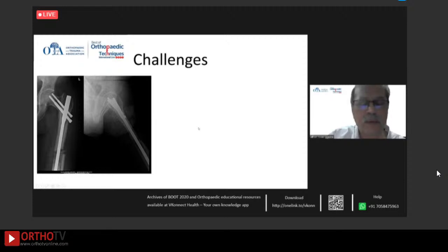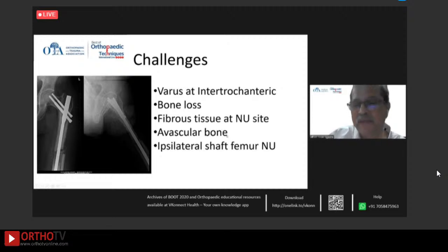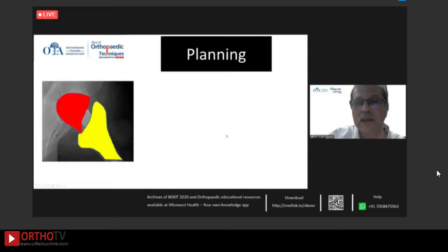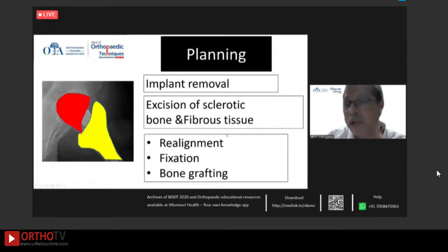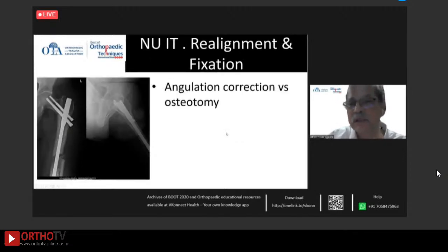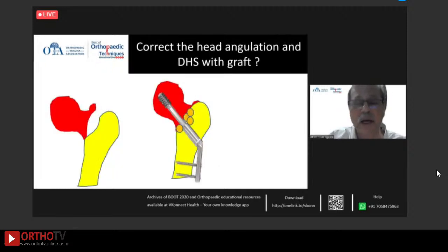So, of course, the challenges were varus, bone loss. Obviously, there's bound to be fibrous tissue at the non-union site and avascular bone. And of course, we have an ipsilateral femur. So, obviously, one needs to remove the implant, excise the sclerotic bone and fibrous tissue, and we need to realign, fix, and graft. The question was, do we do an angulation correction osteotomy, and whether we use a single implant or a double implant or replace?